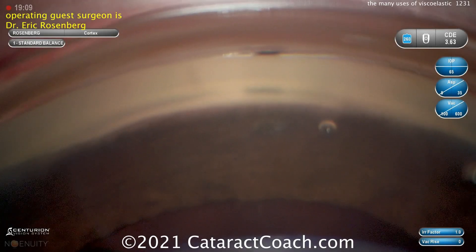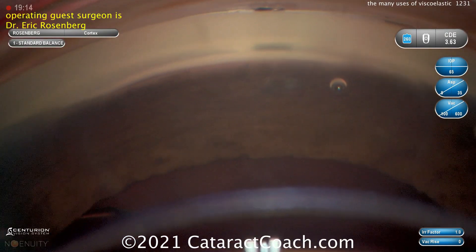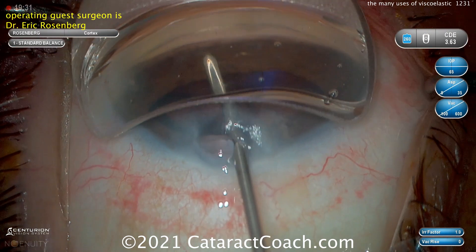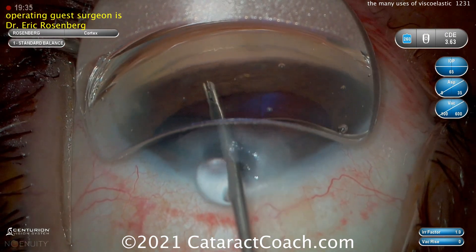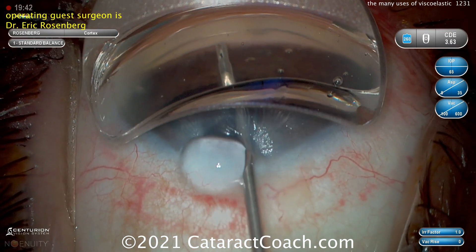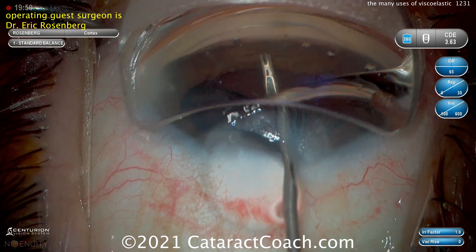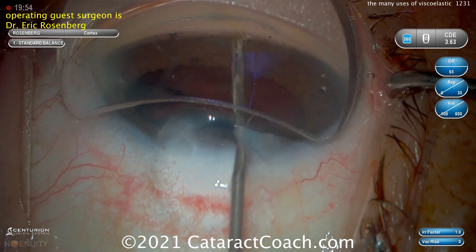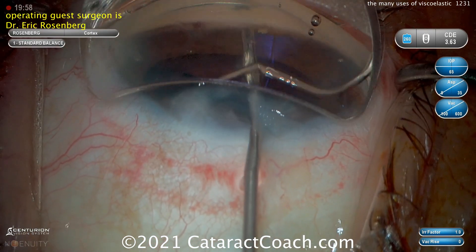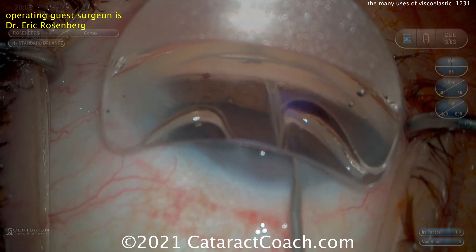Nice pearl there, thanks for sharing. Now our next operating guest surgeon is Dr. Eric Rosenberg, and he's showing you an iStent. So a MIGS glaucoma device, an angle-based device that's going to be misfired, and then how you get it out of the eye — it's such a tiny little thing, it's almost impossible to grab with forceps. There's one going in and it looks pretty good. And here's the second one — this is the iStent inject. The second one is going in and he's attempting to do it, which can be a little tricky as we know.